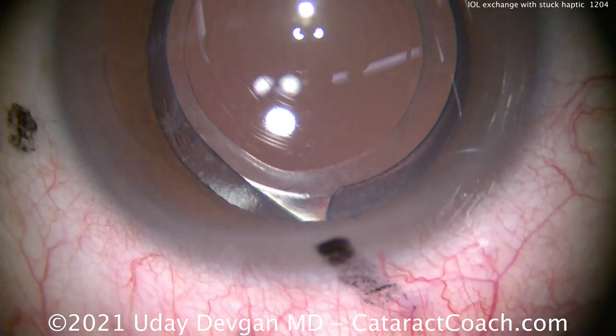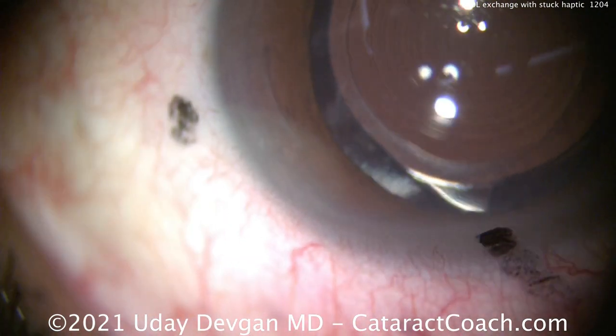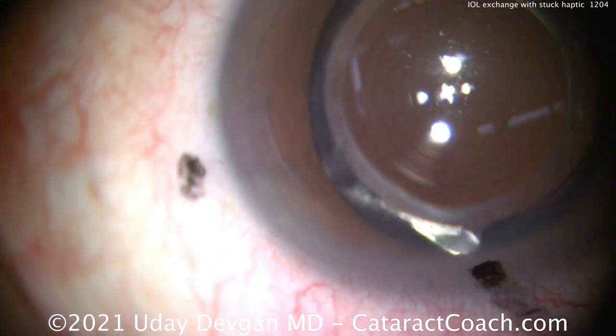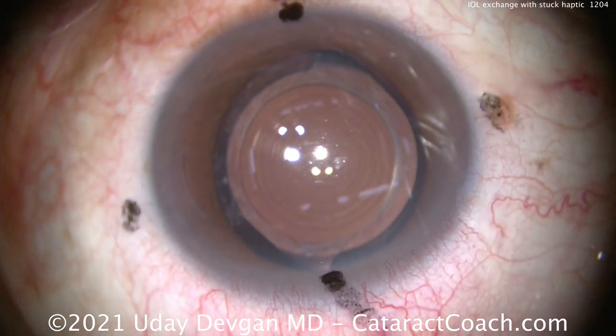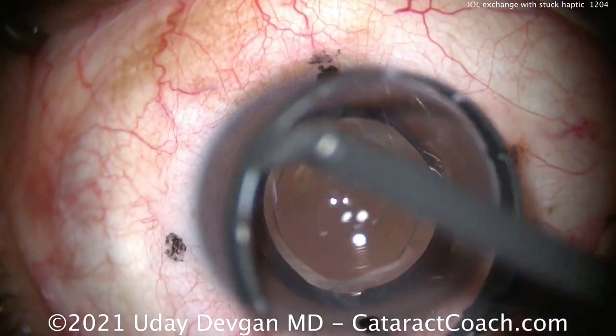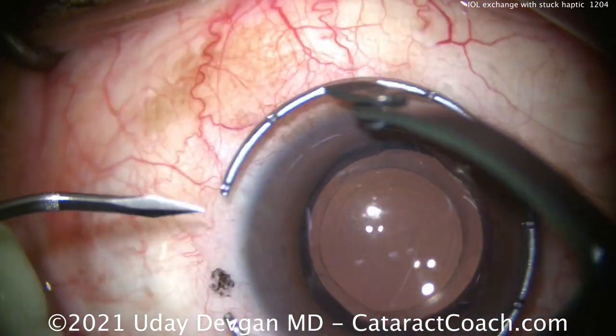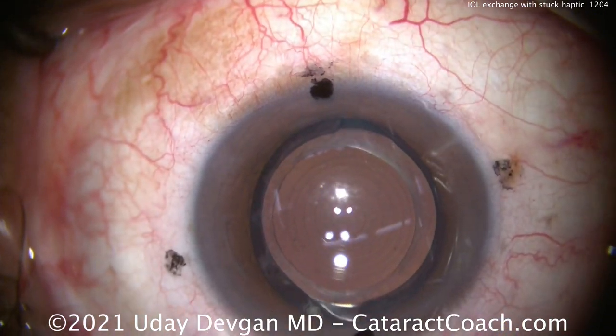The patient had cataract surgery with a trifocal lens about a month ago, and you can see there's the original incision. I don't like it because it's avascular. Also, it's on the flat meridian. This patient had a femtosecond laser capsulotomy, but this patient's just not happy having the vision compromised that's inherent in any trifocal IOL.